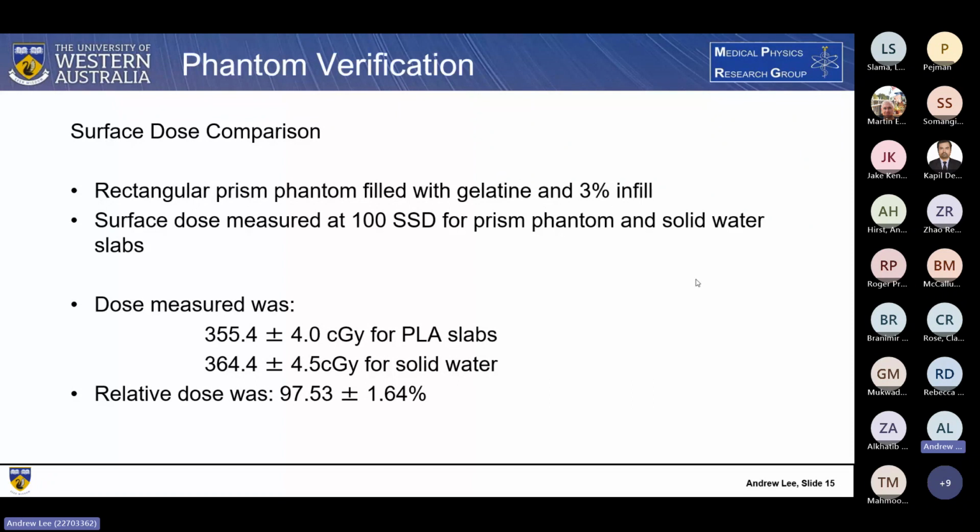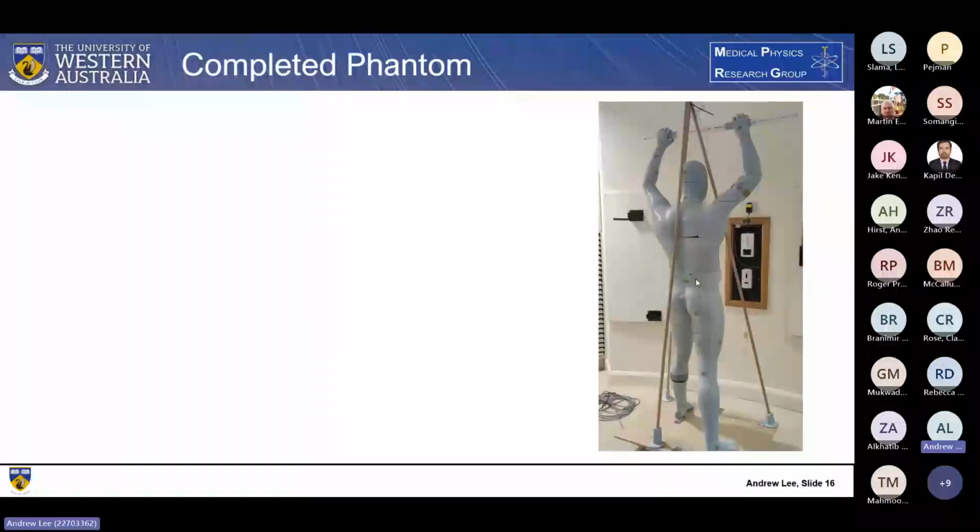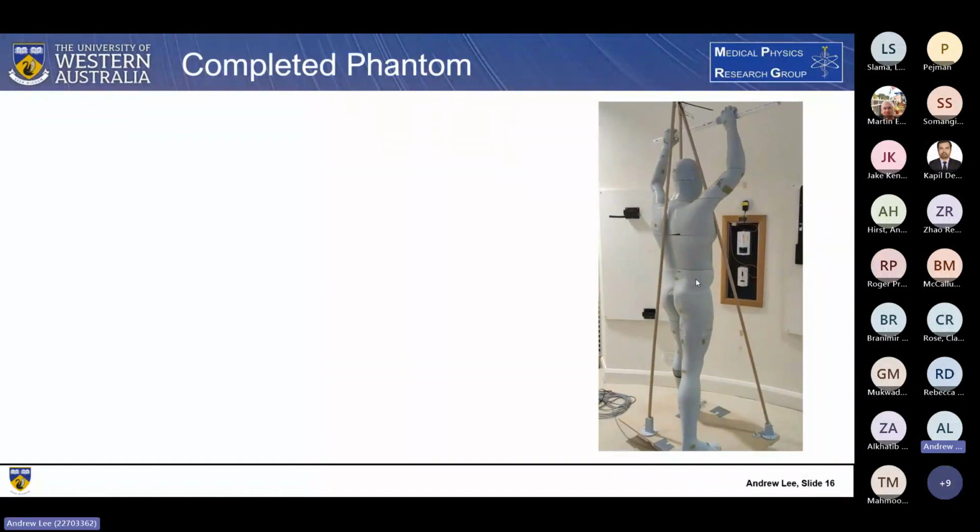There is some difference still, but for most of our phantom, we're going to be taking measurements in terms of relative dose compared to our reference point, which is our umbilicus. So this is the completed phantom seen on the rotating platform on the right.